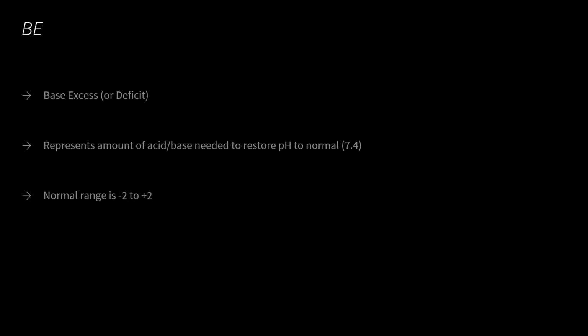Base excess, I'm not going to spend too much time on this. When we're talking about basic ABG interpretation, to be honest, you could interpret it without using it at all. It's just a calculated parameter to control for certain variables on the ABG to tell the provider an actual legitimate excess or deficit of base and how much acid or base it would take to restore a pH back to normal of 7.4.